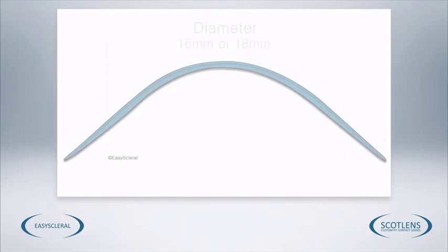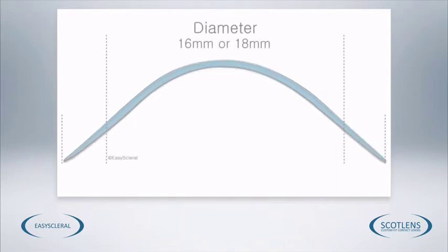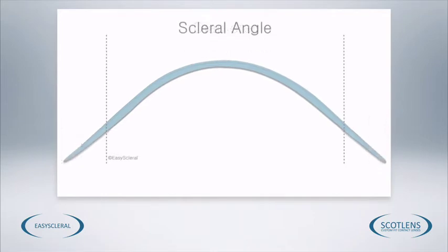So the geometry of the contact lens is supplied either in a 16mm or an 18mm diameter. 16mm is better for less irregular corneas where there's less ectasia. 18mm will be needed on more extreme forms of corneal ectasia. The lens fits the eye on the sclera, and this can be adjusted as the scleral angle, either standard or plus or minus, and these can be increased or decreased in 4-step changes.